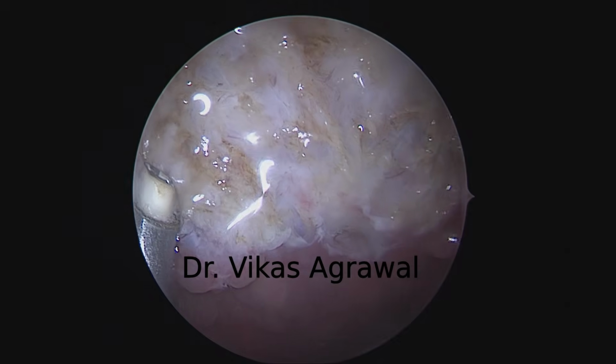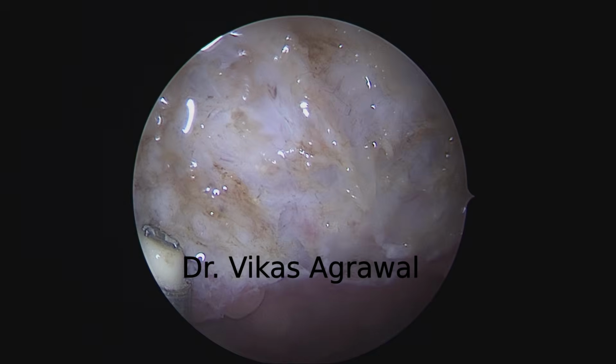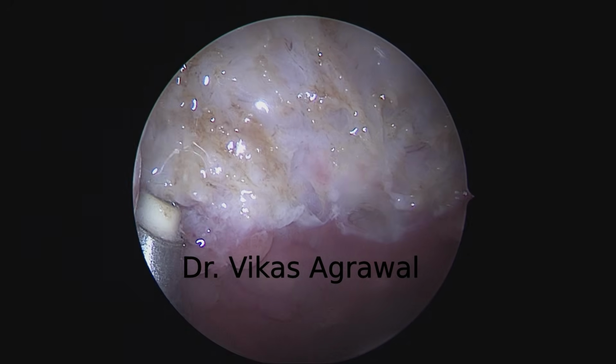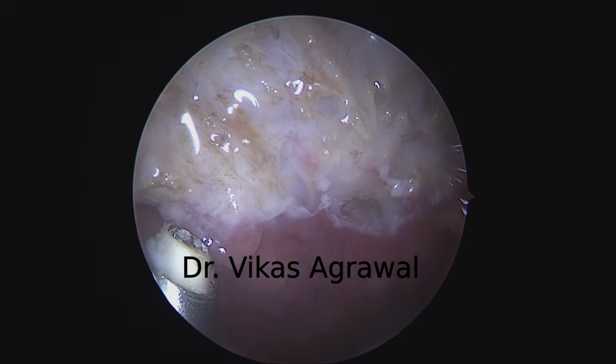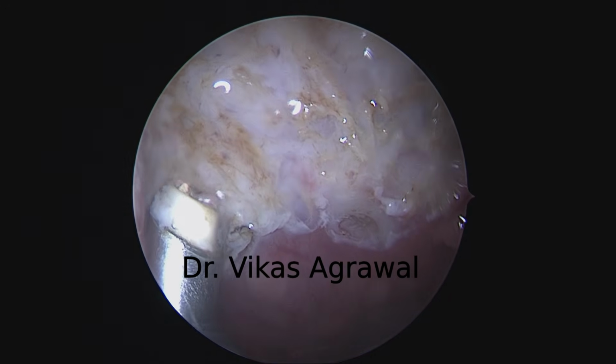If there is still some lymphoid tissue over there in the lateral recess, you can simply coagulate it. Suppose if this is the area and you do not want to ablate, you can coagulate. But here, I am very sure, so I am ablating it. Ablation obviously will completely remove the tissues.